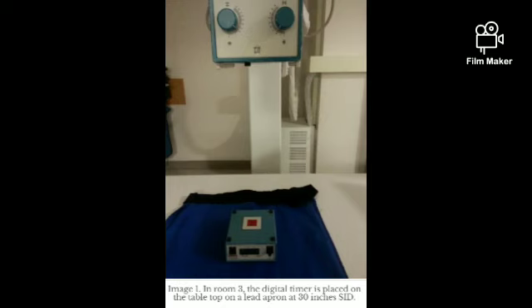Next thing is you have to adjust a fixed 60 kV, and you have to take one at high mAs and another at low mAs. So this will give you the reading that in what range of mAs your machine is giving you the perfect image. Like this you will simultaneously do for 80 kV, 100 kV and so on, using one high mAs value, one low mAs value, and also you can use a mid mAs value, and you will record all the images.